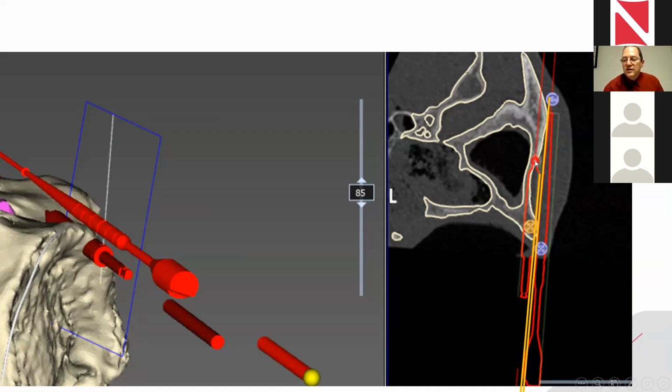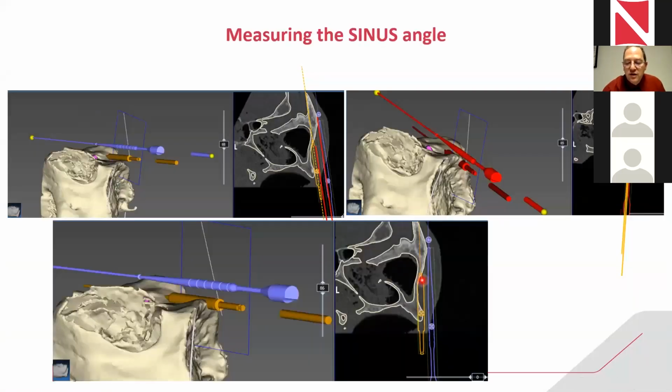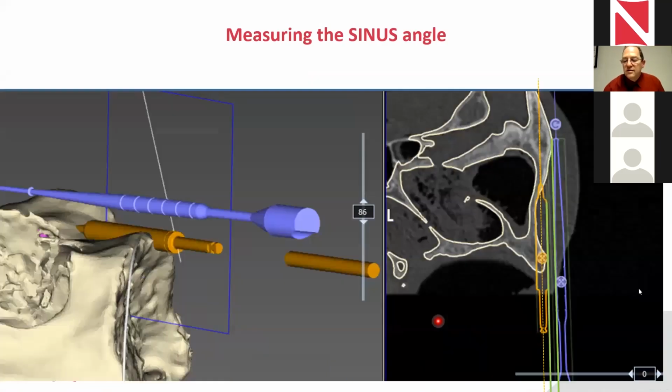When you move the entering point back to this position, you're facing the correct position, and you can see the right distance that you measured before, and now you know you are correct. So this is the tool you can use in order to know where to enter.